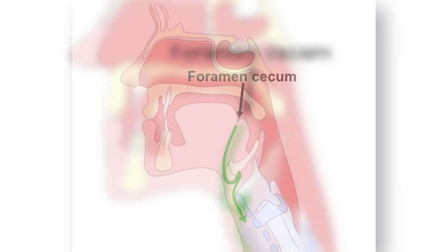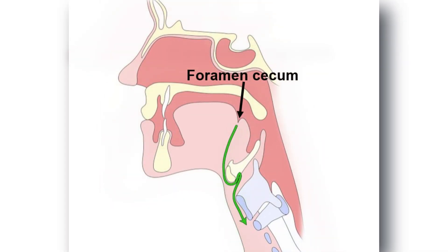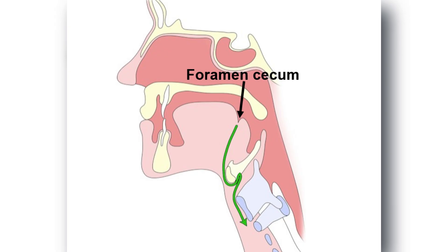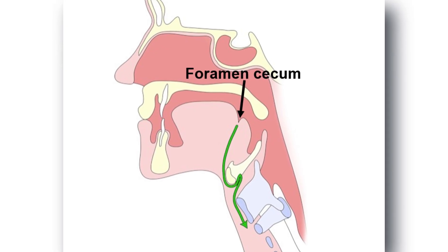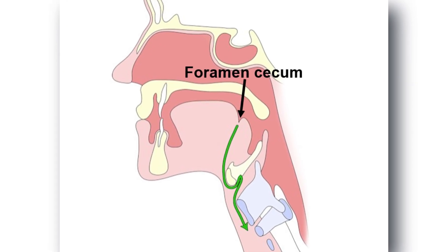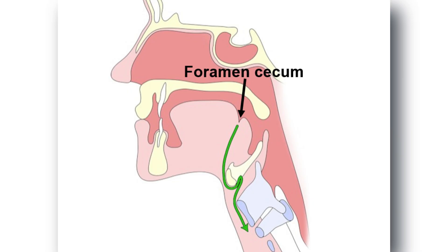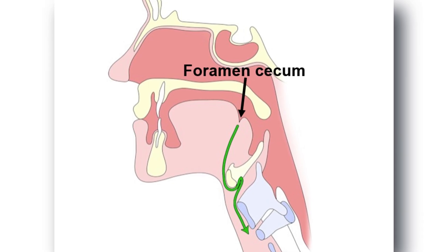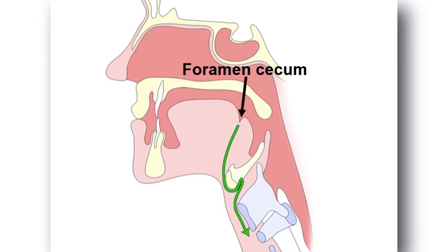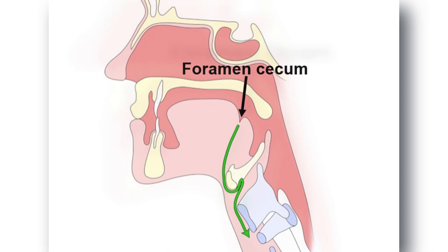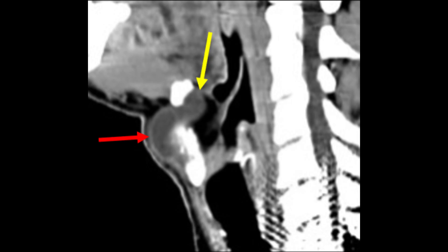They can be located anywhere from the base of the tongue at the foramen cecum to the lower anterior neck below the hyoid bone. 50% are found at the level of the hyoid, 20-25% in the suprahyoid region, and another 25% in the infrahyoid region. In our patient, the cyst is infrahyoid and midline with extension into the preepiglottic space, an unusual but recognized finding.